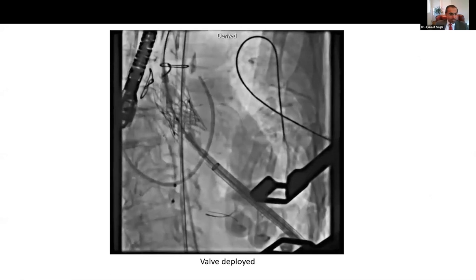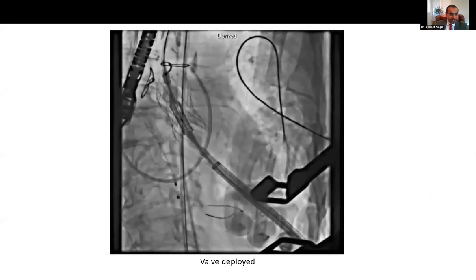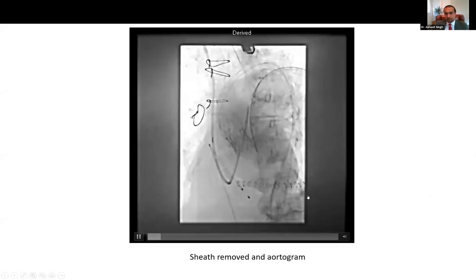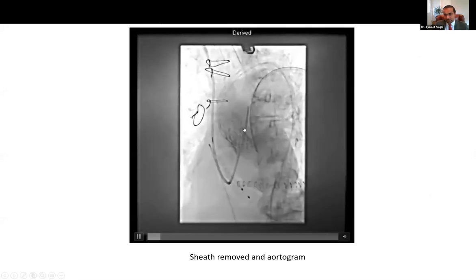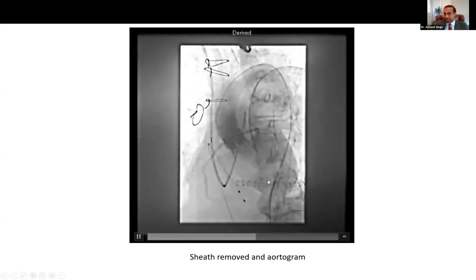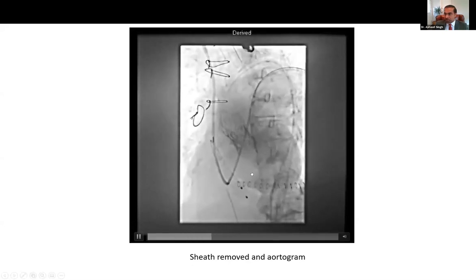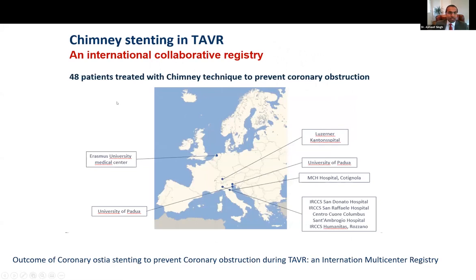However, we had a small issue later on, that there was bleeding at the apex where the surgeon had ligated and closed off the puncture site, and they had to put an extra suture in the apex. As you can tell, the coronaries are open, the left main is open, the right coronary is patent. However, the distal part of the apical LAD has poor flow where the surgical sutures went in at the apical site. Overall, this patient did well and had a small peri-procedural infarct related to the loss of flow to the apex, but otherwise the patient did fine.